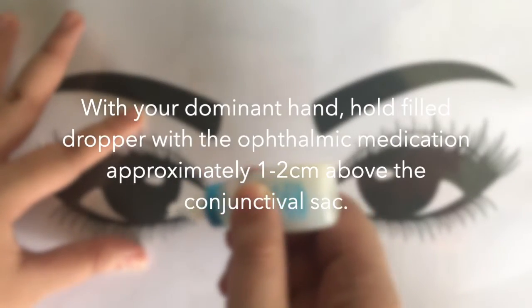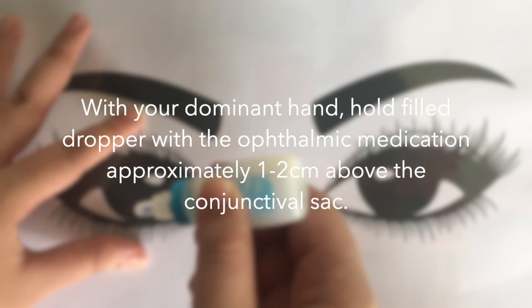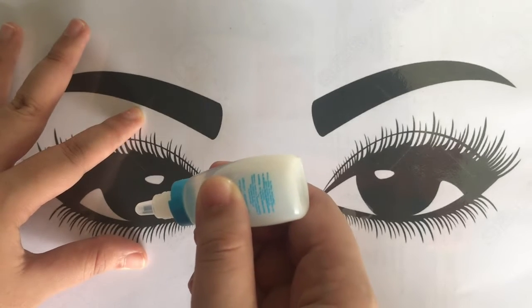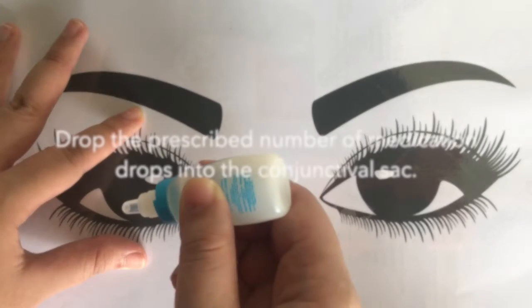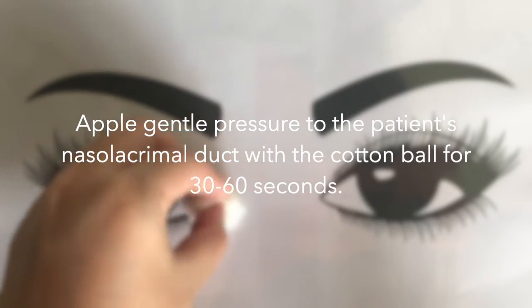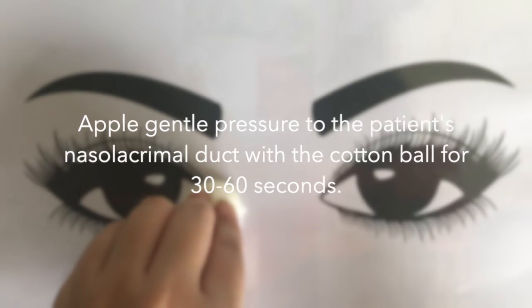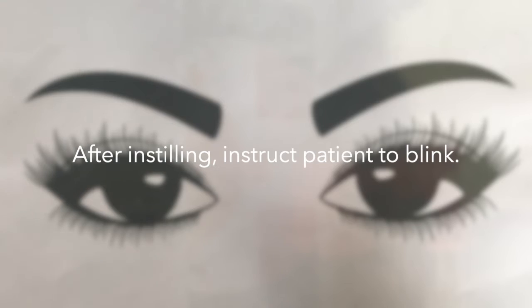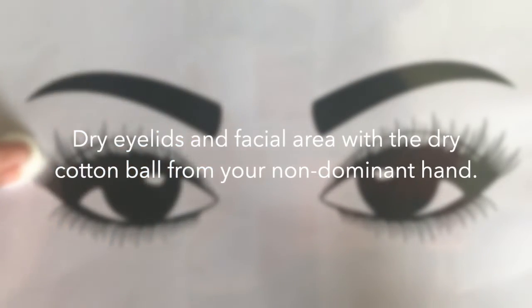Next, with your dominant hand, hold the filled dropper with the ophthalmic medication approximately 1 to 2 cm above the conjunctival sac. Then ask the patient to look up. Then drop the prescribed number of medication drops in the conjunctival sac. Next, apply gentle pressure to the patient's nasolacrimal duct with a cotton ball for 30 to 60 seconds. After instilling, instruct patient to blink, then dry eyelids and facial area with a dry cotton ball from your non-dominant hand.